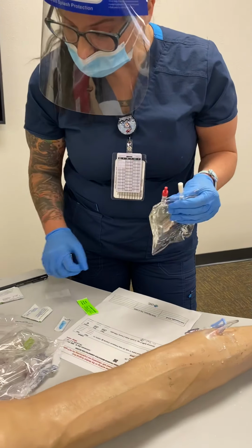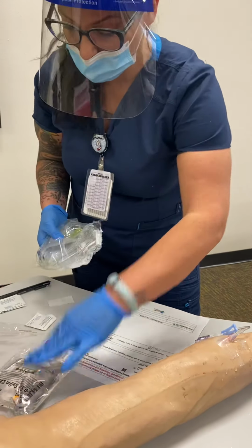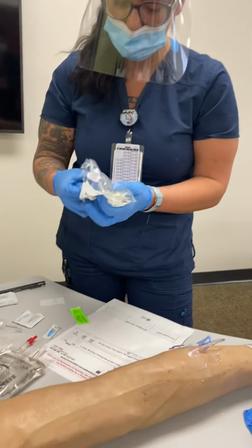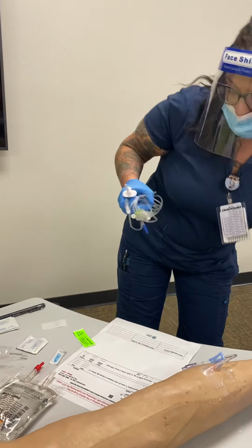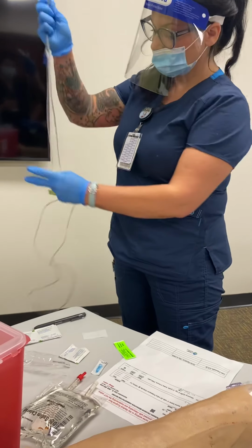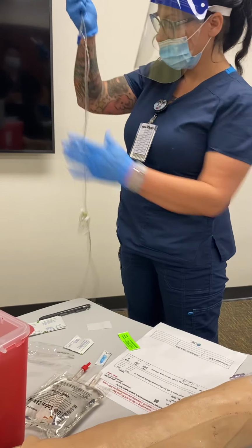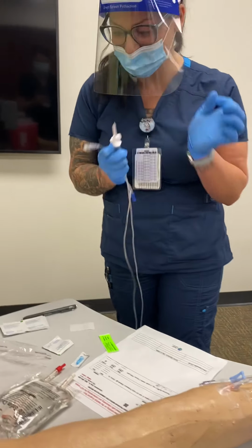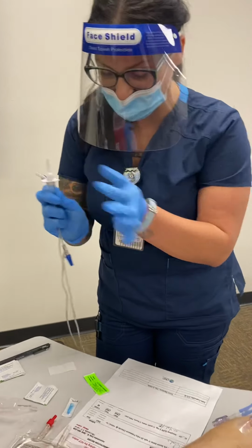So go ahead and get your tubing. Make sure your cassette is closed. This normally has a lid on it. I don't know where that went, so that would have a sterile lid on it.